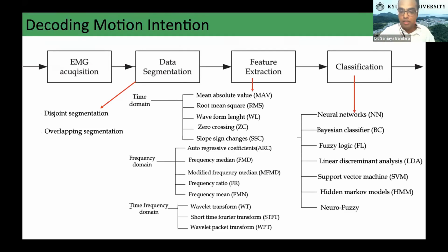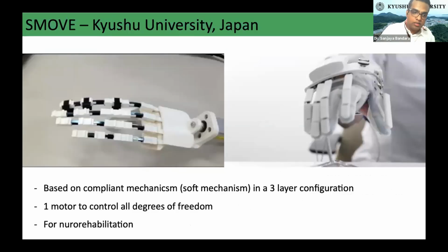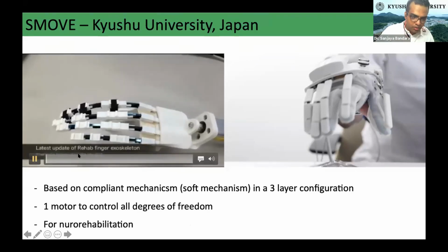Now this is using machine learning. For example, we can use neural networks, which are kind of a black box, similar to how we understand the human brain and our neural system, or fuzzy logic, for example. Also recently some deep learning techniques have been developed to understand this kind of human intention. So next I will show you a couple of projects that we were working on.